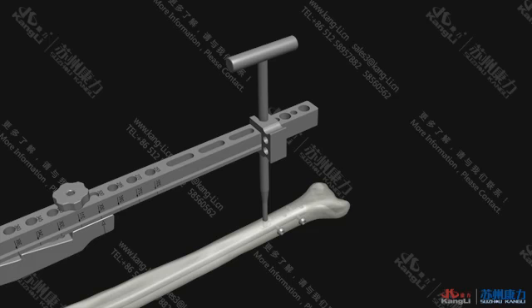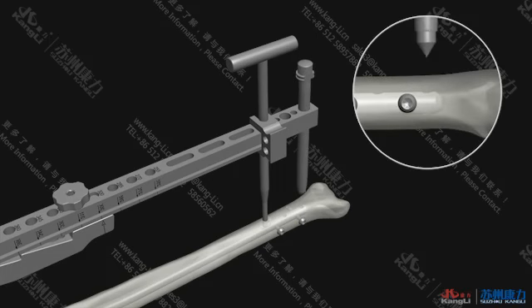Insert the soft tissue separator and outer sleeve at the front and rear position of the distal end of the guide bar. After a 0.5 cm long incision is made right under, continue inserting the soft tissue separator and outer sleeve until the bone cortex is reached. Remove the soft tissue separator. Insert the 4.0 inner sleeve and 4.0 pin to drill.